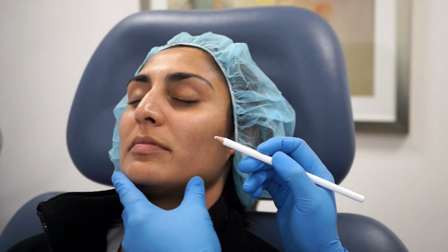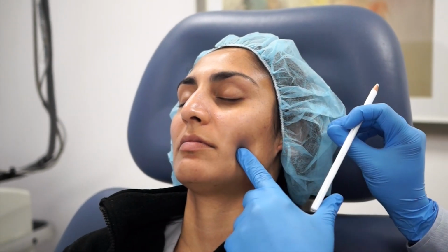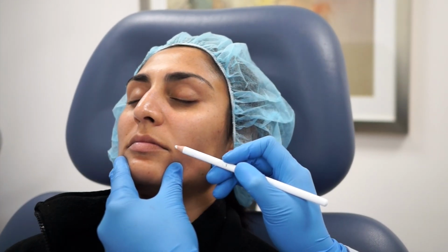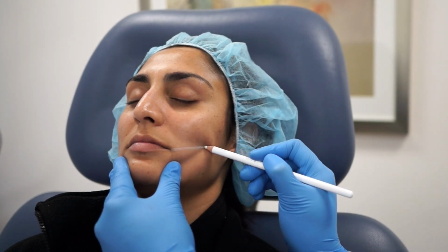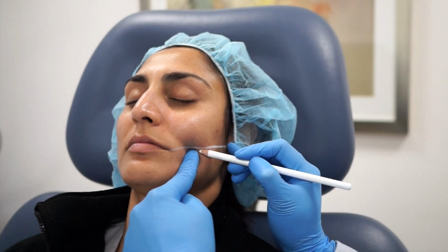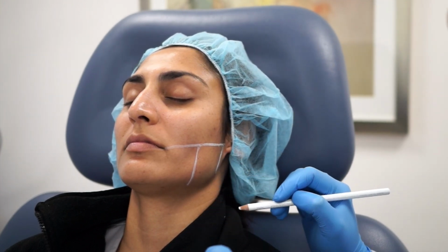We're going to start off by marking the patient and isolating out the masseters. So bite down for me, Angie. Okay, you can feel the anterior border, you can palpate the anterior border of the muscle as well as the posterior border of the muscle. And what I do is I draw a line from the corner of the mouth all the way up to the mid-tragus. And that's the line below which I want to keep all of my injections. Then I mark out the anterior border of the masseter as well as the posterior border, which is just going to be the angle of the mandible.